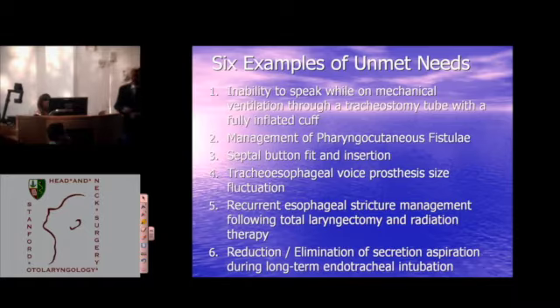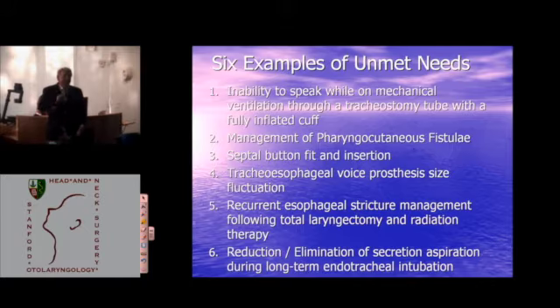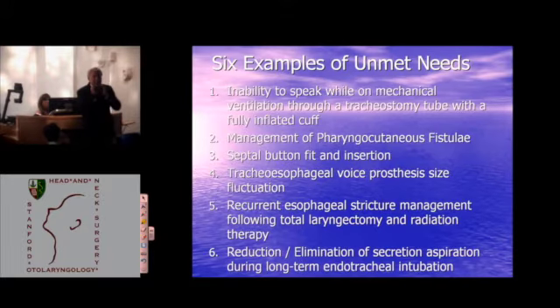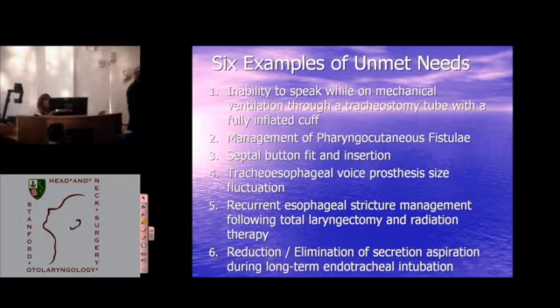Tracheoesophageal voice prosthesis, fluctuation in length. It's a problem that I've seen for years, where your patient will come in, the prosthesis will be retracted back in the tissue because they've had some event where the wall has swollen. We have patients that two or three times a year have this flare-up that occurs over a 2 or 3 day period. It comes on pretty rapidly, and they show up and their prosthesis is retracted back in the tissue. You've got to get it out, you've got to put in a longer prosthesis. Within a week or two, they're back in your office, and it's too long, and the flare-up's over. So some thoughts there and some innovation there.